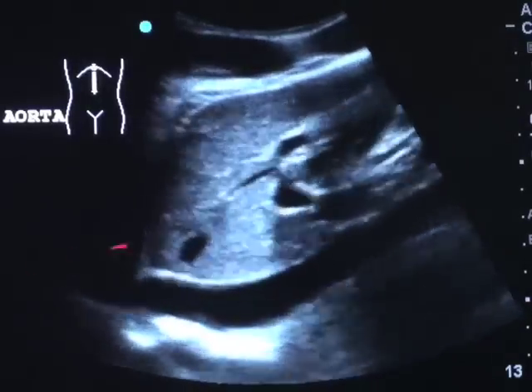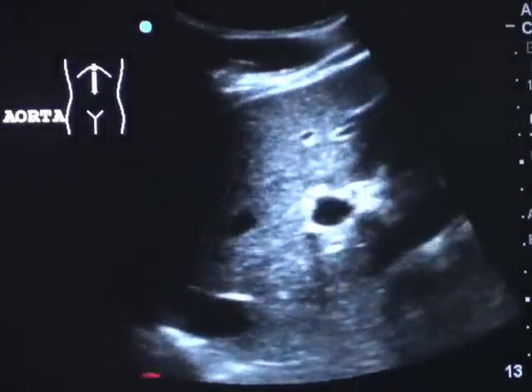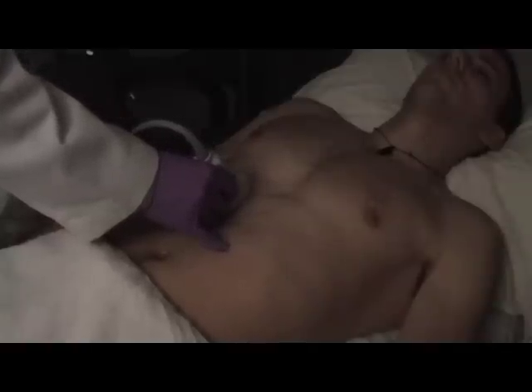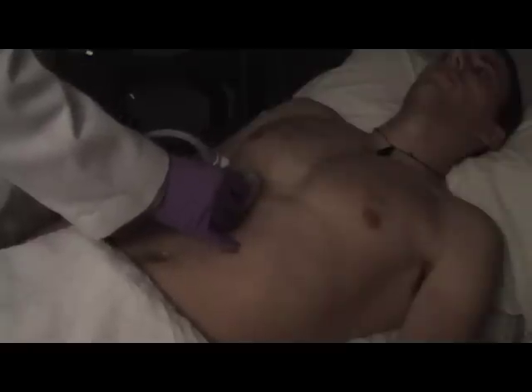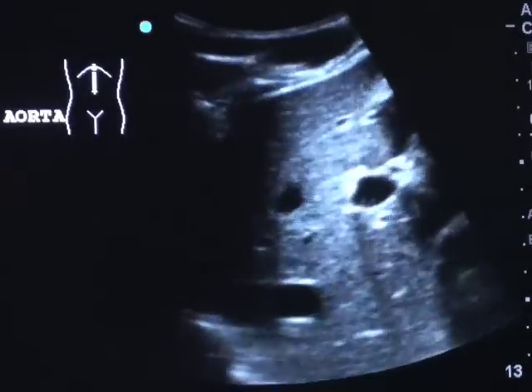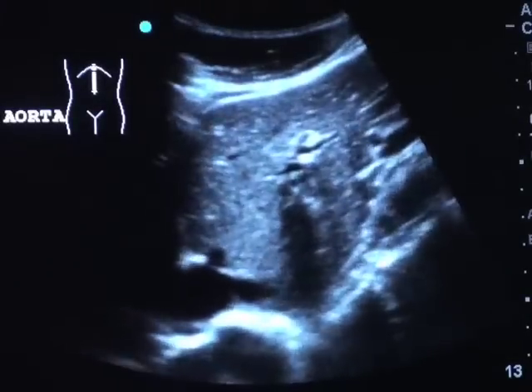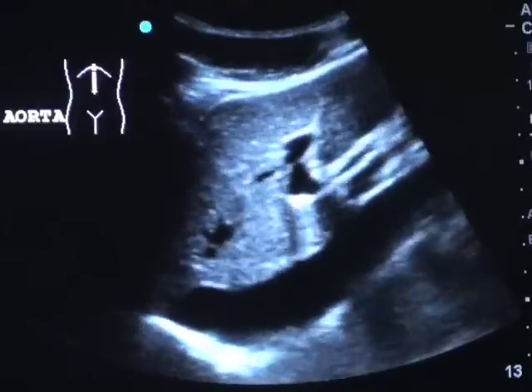the right atrium. Some of the landmarks to try to locate the IVC are the caudate lobe, the ligamentum venosum, and the middle hepatic vein. Don't be fooled by transmitted pulsations. The IVC can have pulsations secondary to the abdominal aorta. But the IVC goes through the liver while the aorta will traverse next to the liver. And Dr. Atkins is scanning, showing the IVC as it drains into the right atrium.